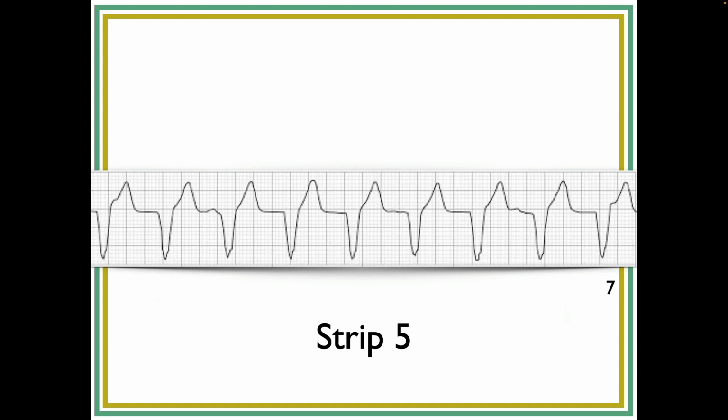It's about 80, so it's between 40 and 100, so I'm gonna say accelerated. Yeah, so this one's accelerated. I'm guessing what happened is the one in here is right on about 100? Yeah, so it was borderline, so it was a bad example to use. So this is also known as ventricular escape. It's accelerated ventricular escape. Accelerated.